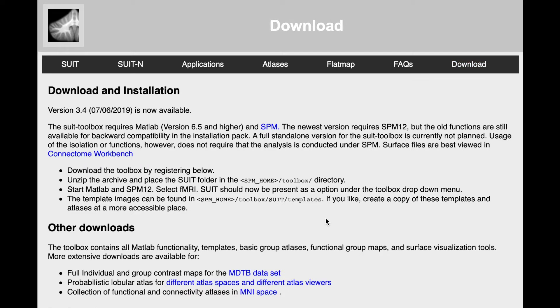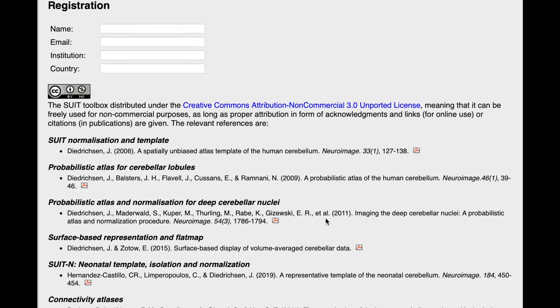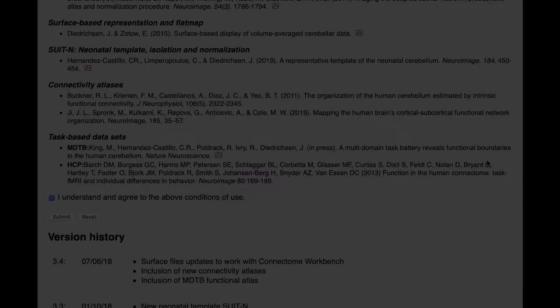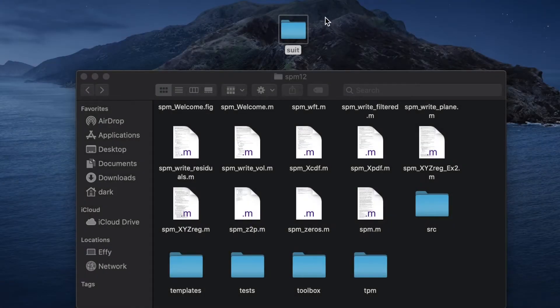Once you downloaded the latest version of SUIT, be sure to place the folder in the right location, so SPM and MATLAB know where to find it.